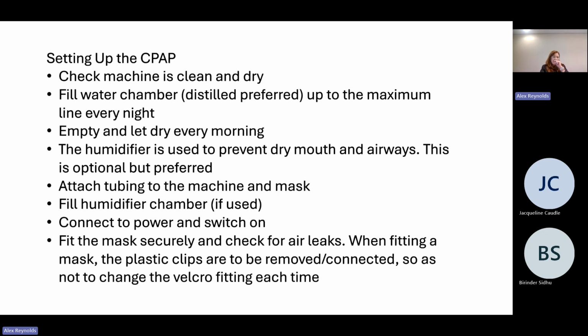So, setting up the CPAP machine. We'll all go through this in a bit, so we'll just talk through it at the moment. You always check that the machine is clean and dry. Fill the water chamber, preferably with distilled water. Is that what we currently use, or just normal water? Amanda pretty much does it on. Okay. But we don't order distilled water in for her, so she's probably just using tap water.